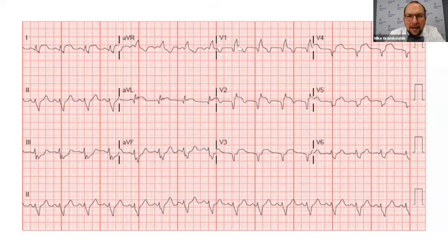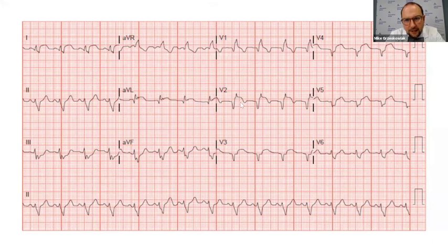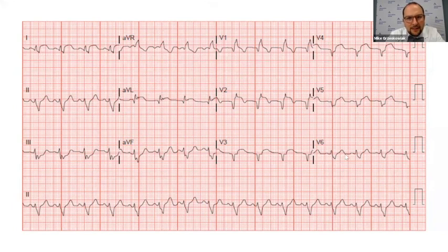Looking at V1, we see a wide QRS complex that's positive in V1 — so this is a right bundle branch block — and we see T-wave inversions. Looking at V2, we see ST elevations: drawing a line from baseline to baseline, this portion is significantly elevated, definitely more than the two-millimeter cutoff for V2 and V3. Looking at V3, same thing — ST elevations, drawing a line from PR segment to PR segment, definitely two millimeters. Looking at V4, continued ST elevations, a little bit less, and then it flattens out.